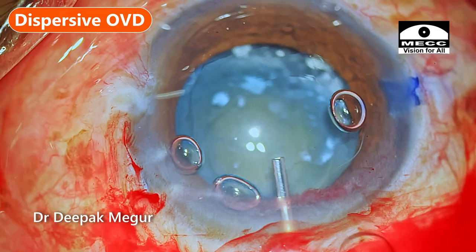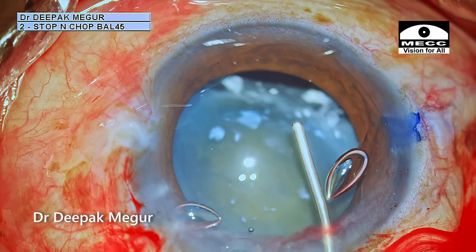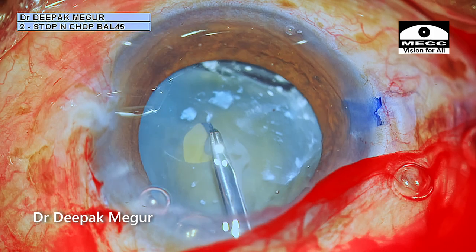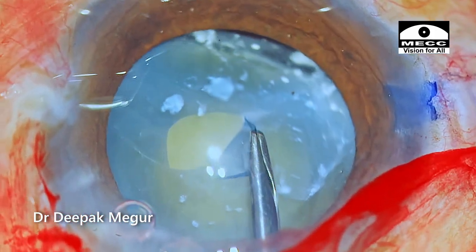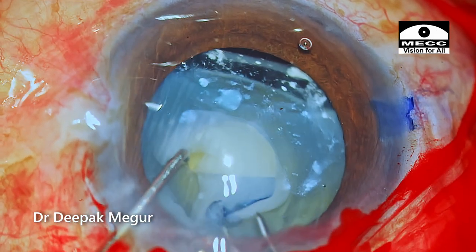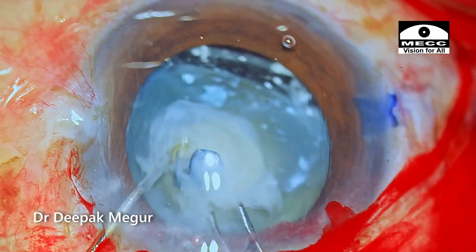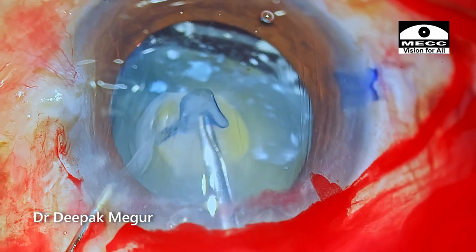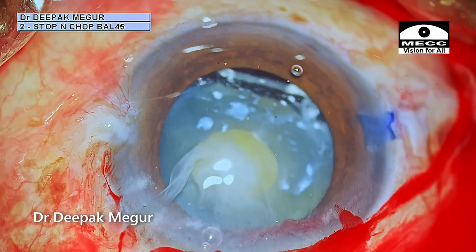I blocked that area by using dispersive OVD, which acts like a tamponade and barrier, and I'm now continuing with my rhexis. The plan is to perform an initial small rhexis, but as I hit these calcific areas it becomes a little bit difficult to tear. Nonetheless, I could achieve a very small rhexis. This was the most critical step of the surgery because it gives me an opportunity to place the CTR inside now.